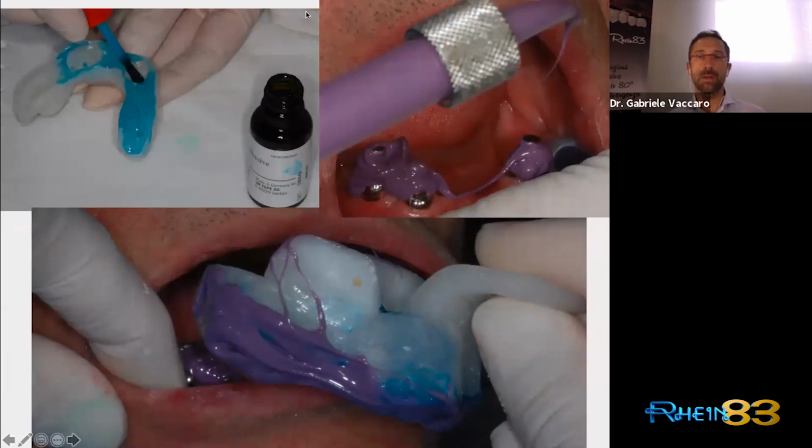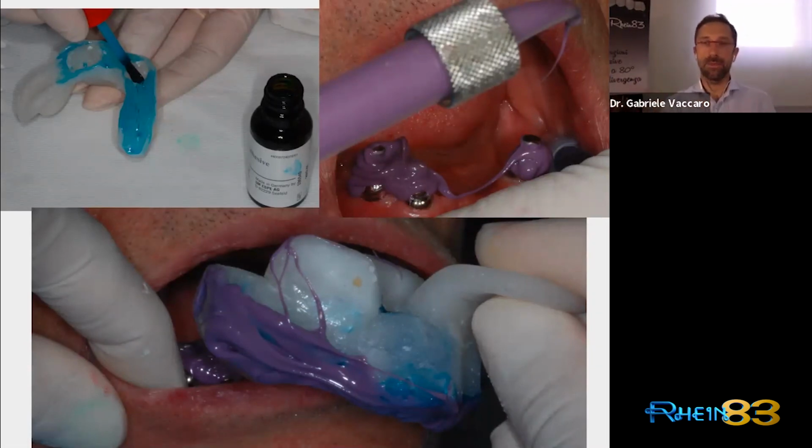Okay, I see that there is a question and answer. If you agree, I can try to understand. Is it more affordable than precision attachment? Yeah, after that, we will ask Niccolo, because he's more prepared to give you the answer to this question. If it's more affordable, you mean by price, if it's cheaper. Well, it is a precision attachment attached to a root. It maintains the precision, but we are not using an implant.